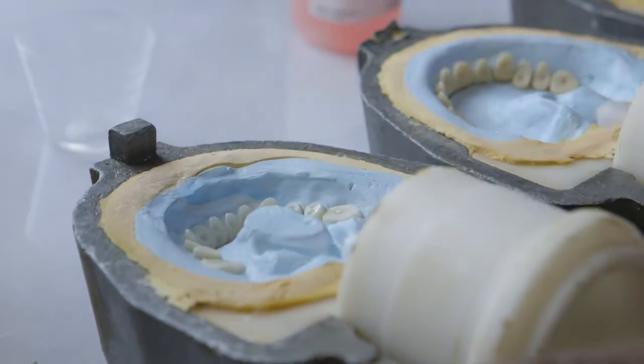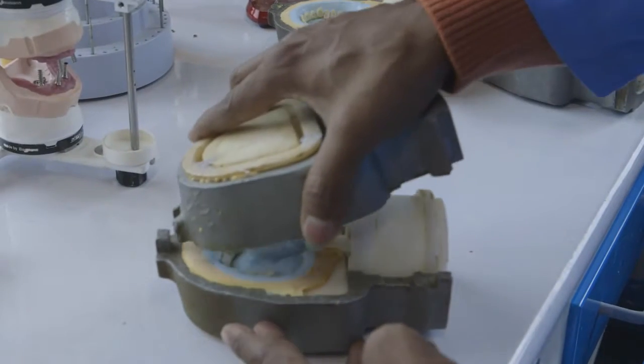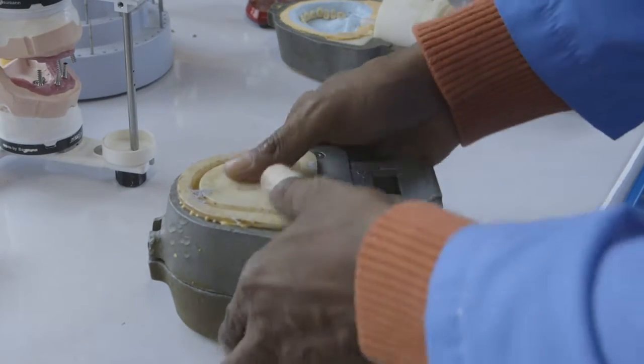You have to gather all your ingredients in order to make a cake, and each layer of cake builds on the previous layer, and dentures are made in a similar fashion.